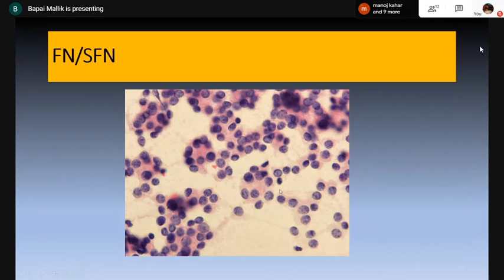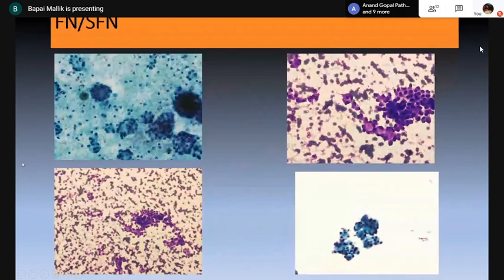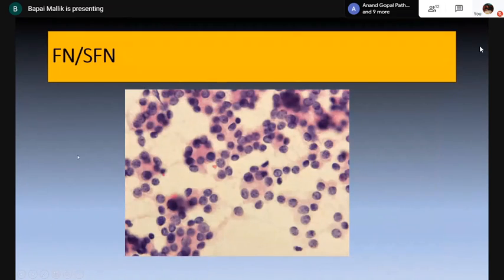And here it's a little bit different. What you see over here, you see follicular cells, but you start seeing the nuclei opening up a little bit, but not too much. Little bit. One moment, I just want to go back. Yeah. So it is just starting to open up a little bit. You might start thinking of putting in the possibilities of going into the next group, possibly. Shall I call it suggestive of or suspicious of malignancy, and put in a note about NIFTP or follicular variant of papillary carcinoma?